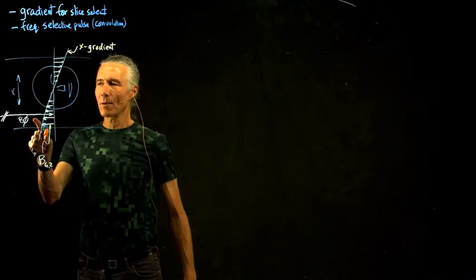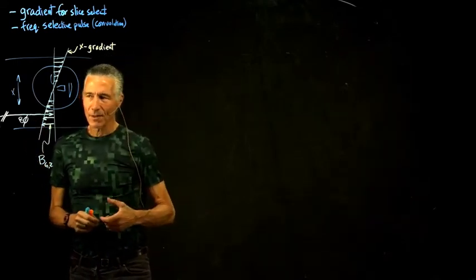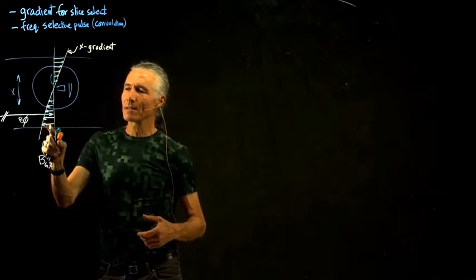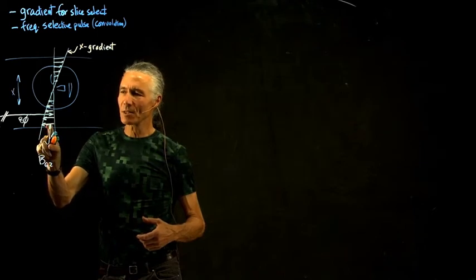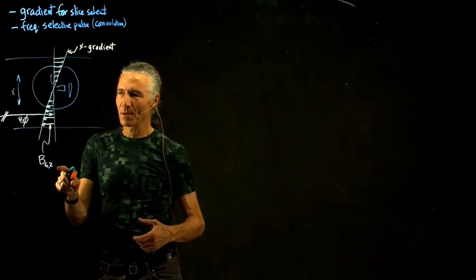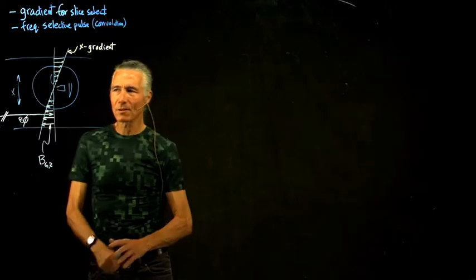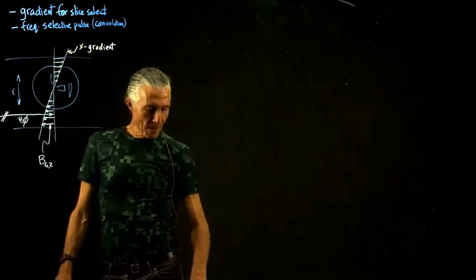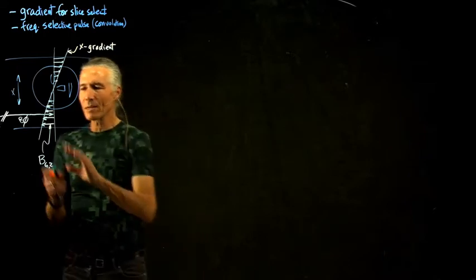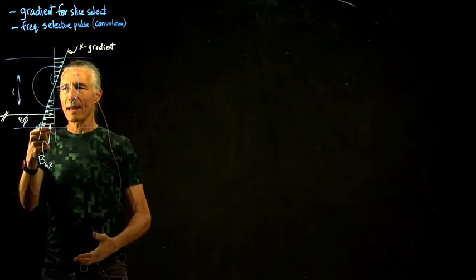If you look at the way Maxwell equations work for magnetic fields, whenever you change the B field, you can't completely just change the Z field and leave the X and the Y fields of the magnetic field untouched. And there are some correction factors that you can add in to take account of that. But to a first approximation, we only care about the Z component of this relatively static field.